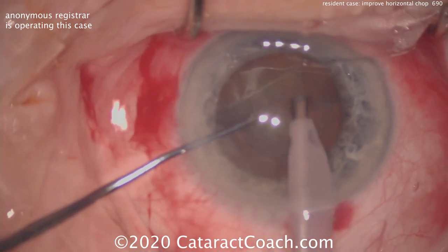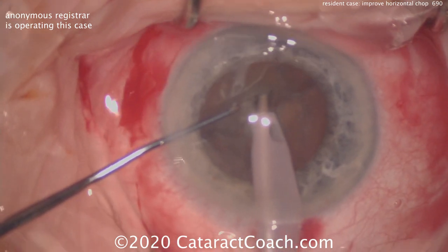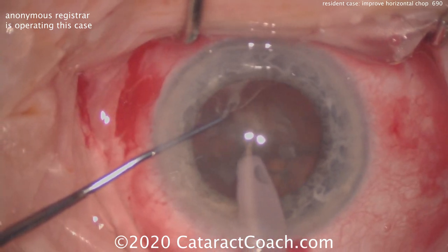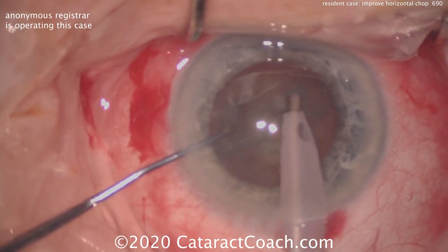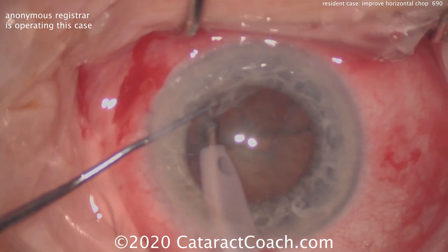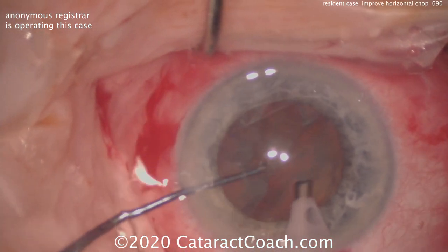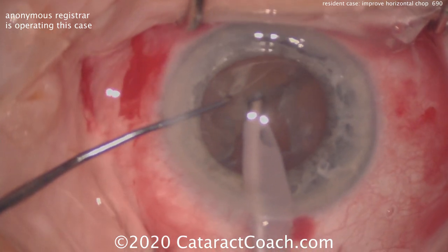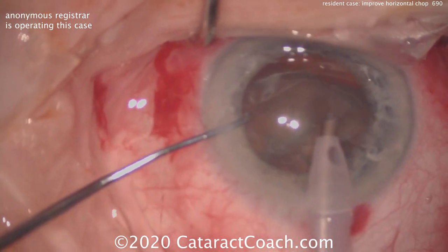The answer is the holding power of the nucleus. The phaco probe did not hold the nucleus, and so the chop did not fully propagate. Trying to bring up a half is going to be difficult because it's not fully separated from the other half. As you buzz in with the probe and try to get vacuum to bring it up, you're just not succeeding. These two halves will try to separate a little more, but the issue was at the beginning — the phaco probe did not achieve occlusion or holding power.